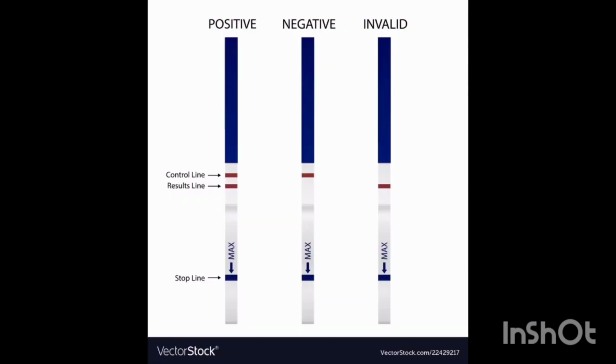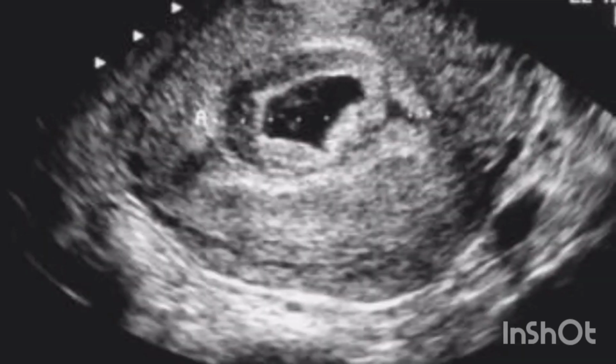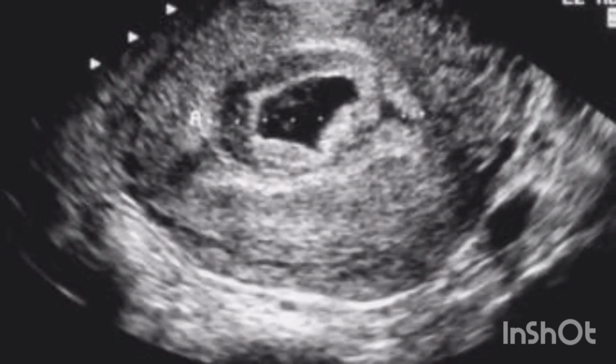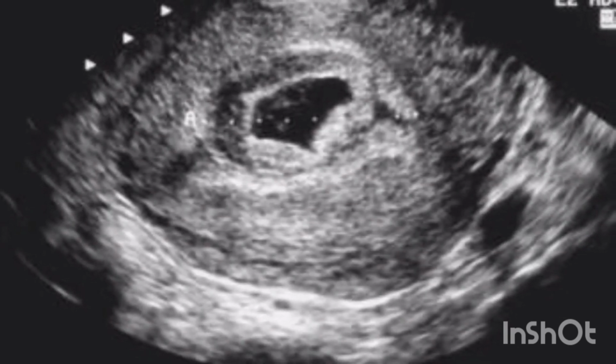In a woman with a positive beta-HCG, any intrauterine sac-like fluid collection seen on ultrasound is highly likely to be a gestational sac. An irregular gestational sac, lack of a smooth contour and/or presence of a distorted sac shape is highly suggestive of an abnormal intrauterine pregnancy.